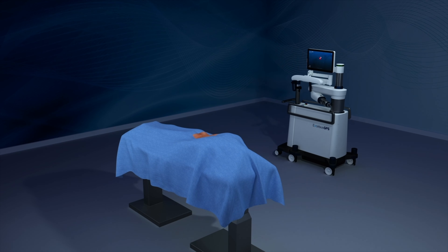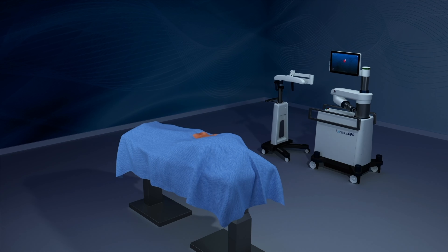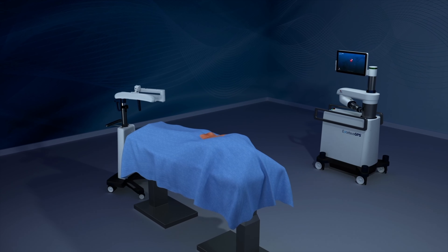Excelsius GPS is the next revolution in robotic surgery, and is designed to improve the accuracy of surgical procedures by using robotics and navigation.